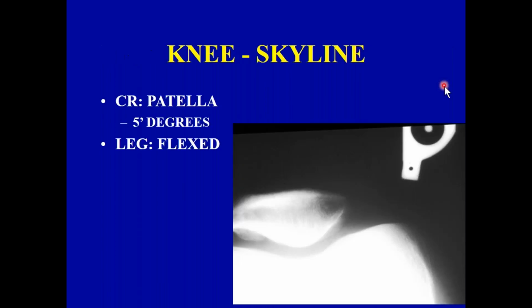Screen artifact, what we don't want, so we've got some other issues. And again, this is an anatomic position, so I probably should put a left marker here, but it's the only example I have, not of a tunnel view, but for this particular sequence of events.